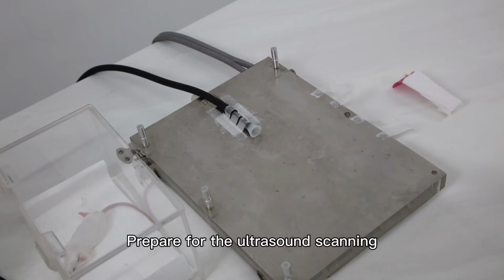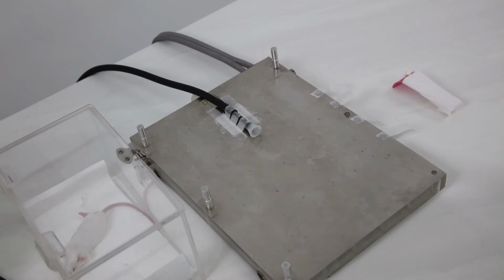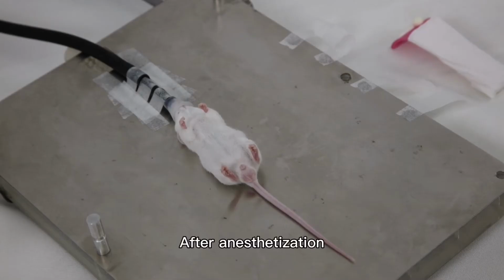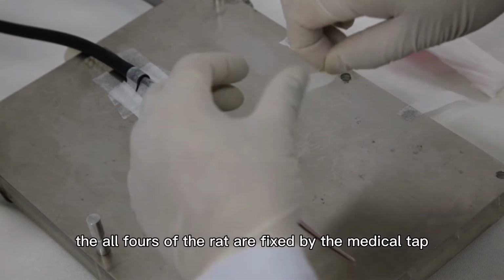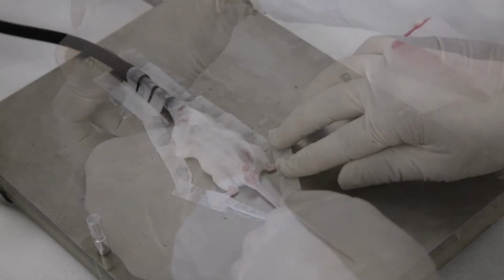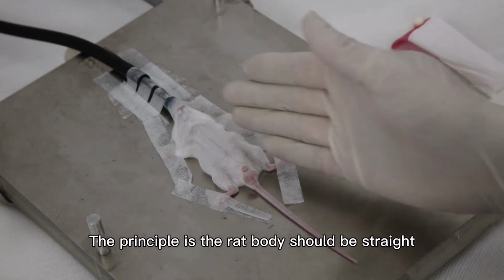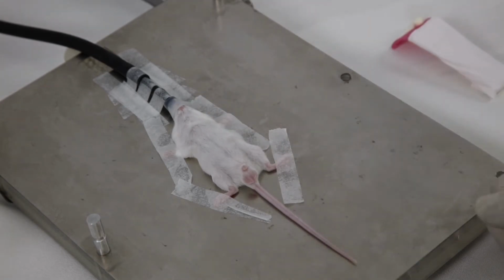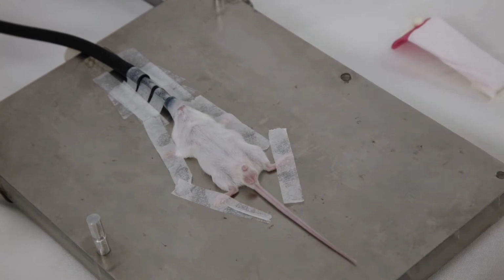Prepare for the ultrasound scanning. Take a rat as an example. Anesthetize the rat. After anesthetization, all four limbs of the rat are fixed by the medical tape. The principle is the rat body should be straight, without twist, with proper tightness. Forelegs are not stretched excessively.